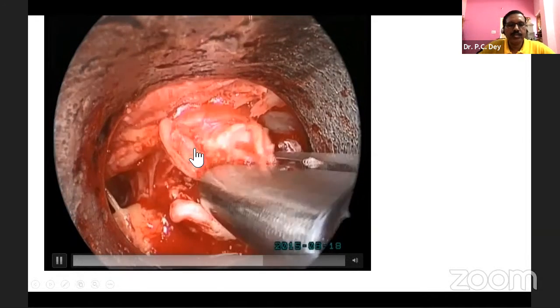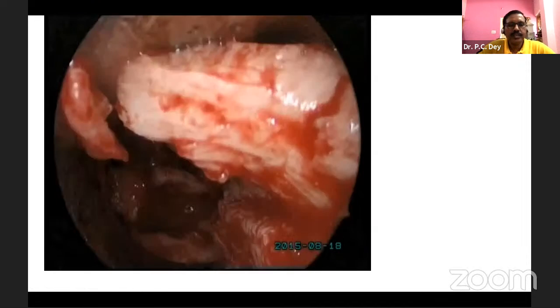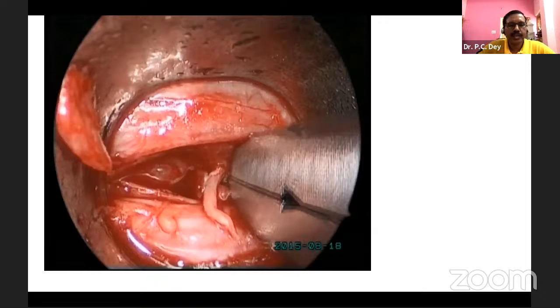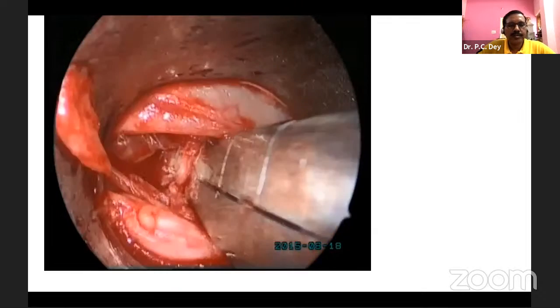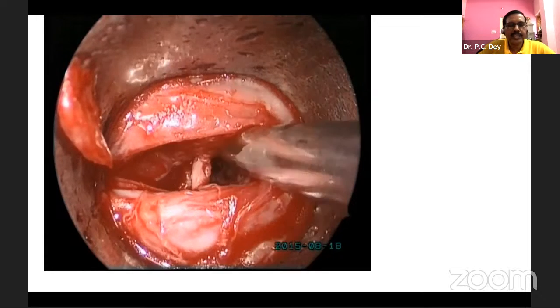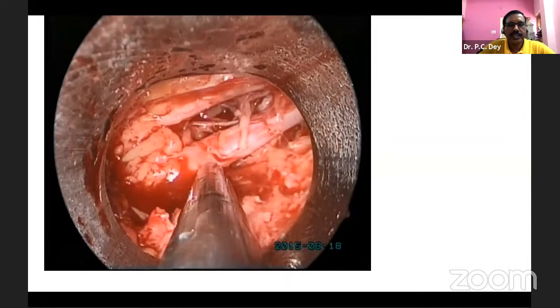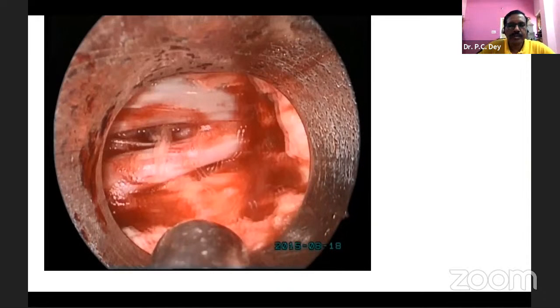We used regular instruments like a 3 mm Kerrison punch and 3 mm disc forceps. There is no special instrumentation for the Destandau technique. After removal of the disc, there was a contained area. Also, there was a small fragment, and we irrigated with normal saline. This takes hardly 20-25 minutes of surgery, and the clear visualization is very good.